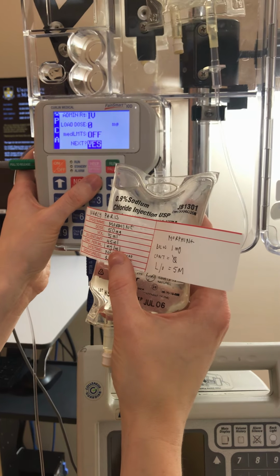We're not setting up a basal rate, but we are setting up a patient bolus. We want them to get 1 milligram when they press the button. And the lockout, so the time that the patient will have to wait between requests for boluses, is 5 minutes. She's going to get 12 boluses per hour. That's 60 divided by 5. And we're done. Okay, so at this point we can just change the bag and set it up.